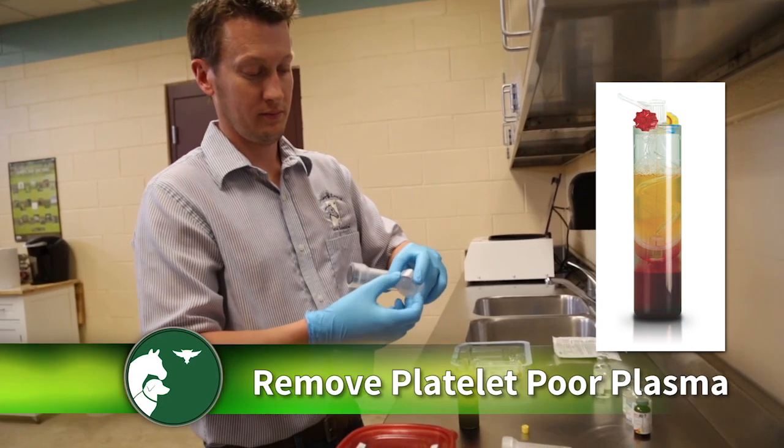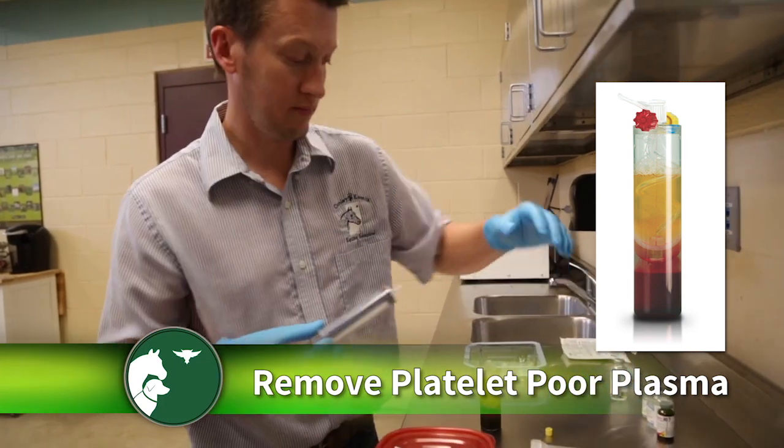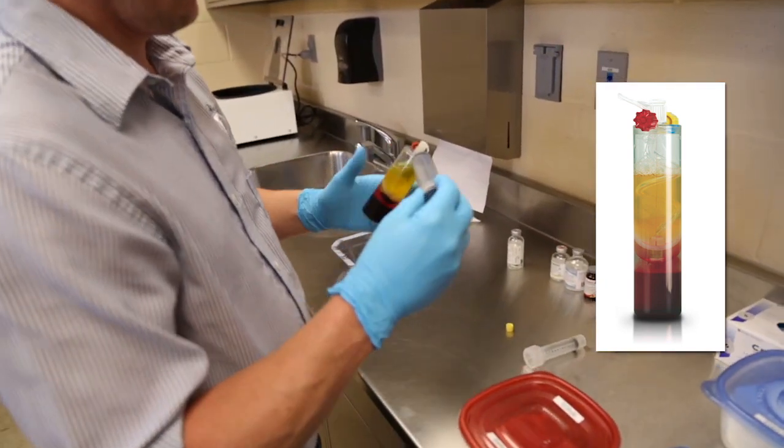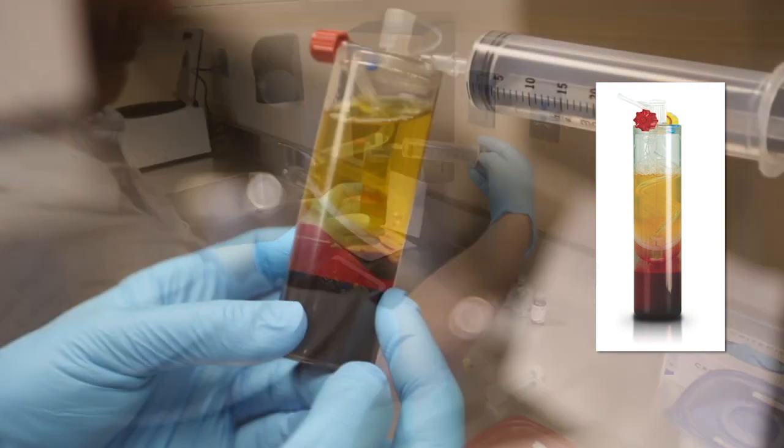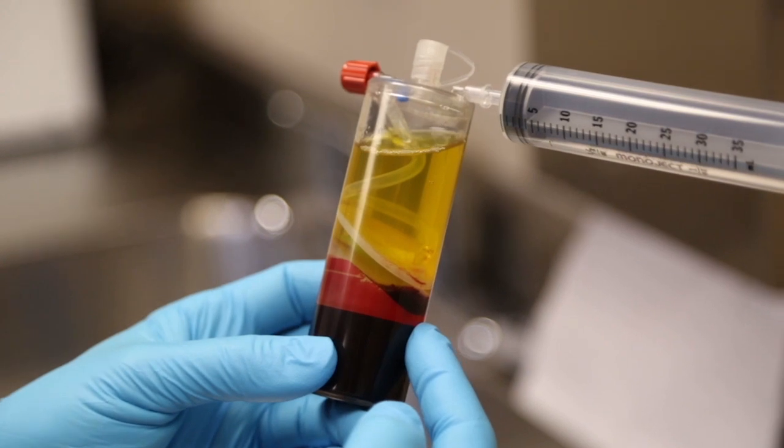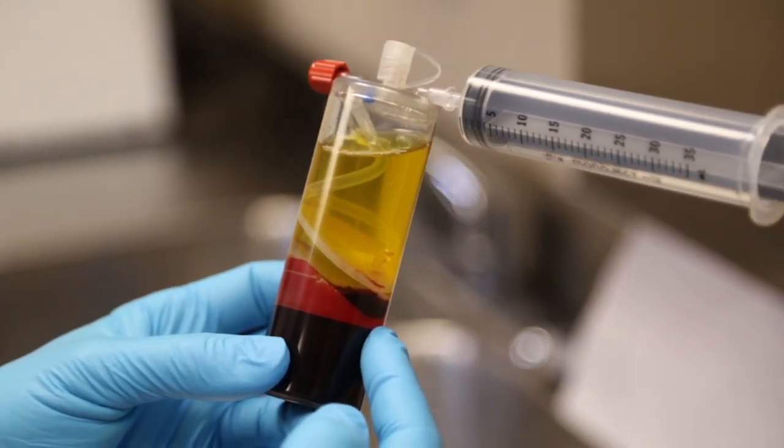Remove the platelet poor plasma first. This is recommended to ensure that the platelet-rich cell suspension is not diluted at the time it is being drawn out of the device. Remove the yellow cap from the device, labeled number 2, and connect a 30 ml syringe to remove the platelet poor plasma.